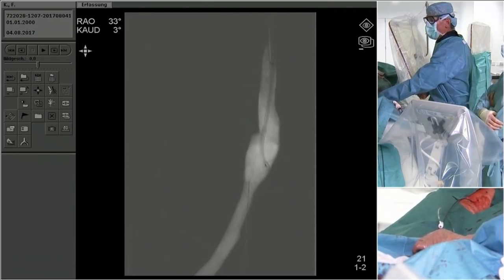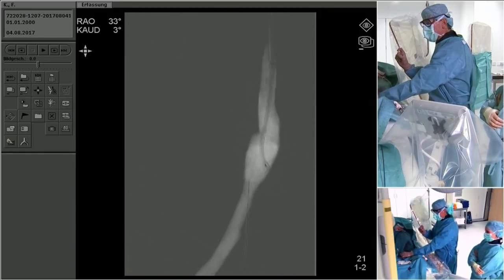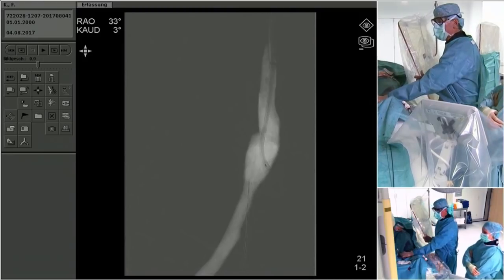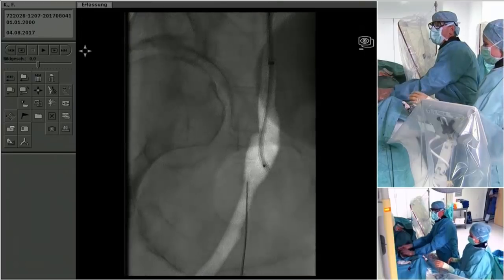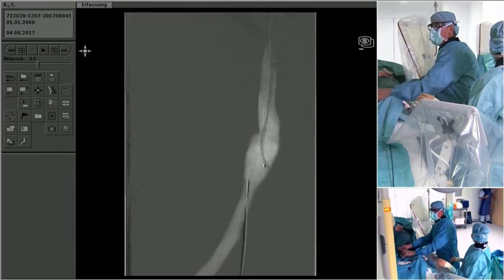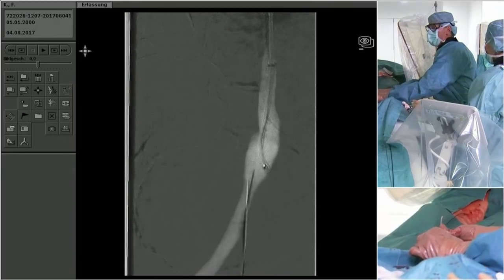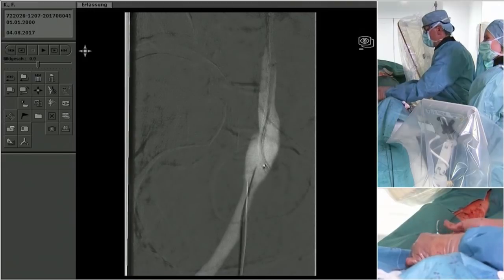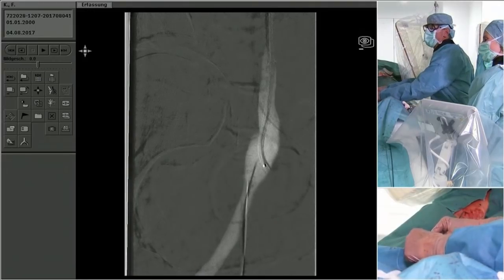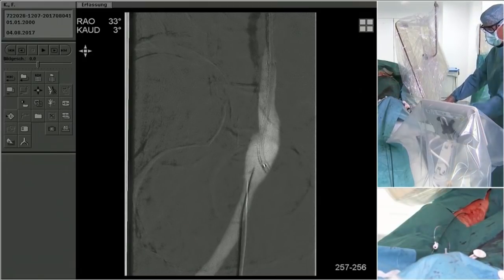And this angulation is also not so bad, but as you have seen from the other angulation, I think the angle of the needle is not enough to give me the appropriate push to get the needle back in. So I twist the needle, as you can see here, a little bit back and give it a little higher, maybe here. And that angulation, and leave it like this here and change angulation again.